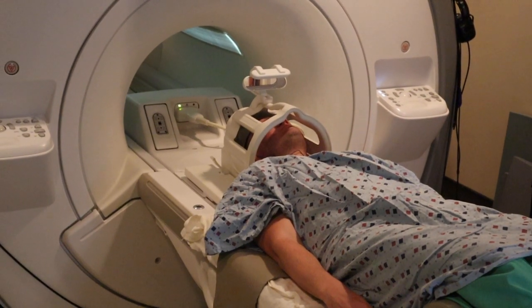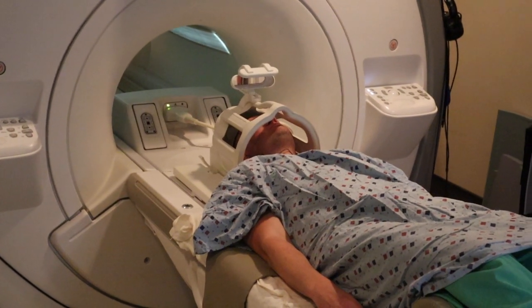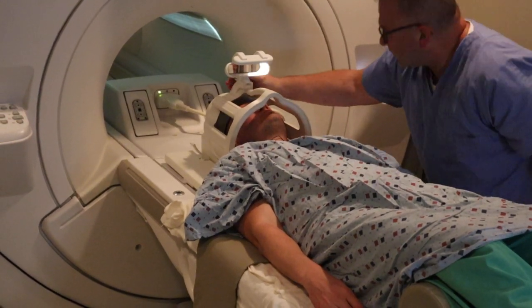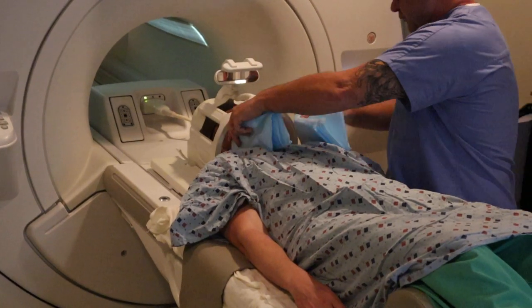You can now see the technologist is putting on the brain coil. The reflector allows the patient to see outside of the unit when inside the unit.